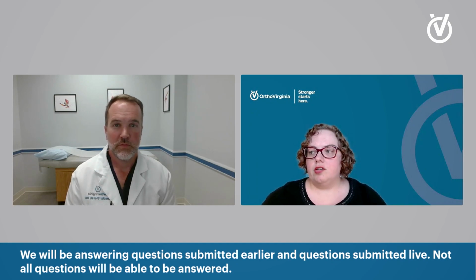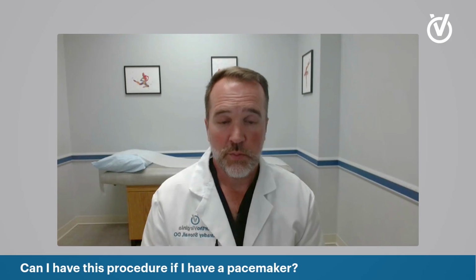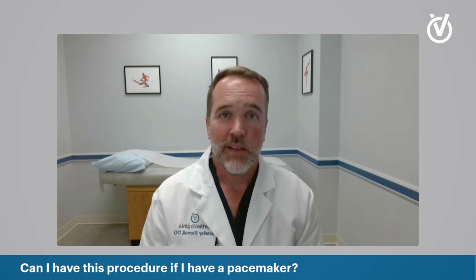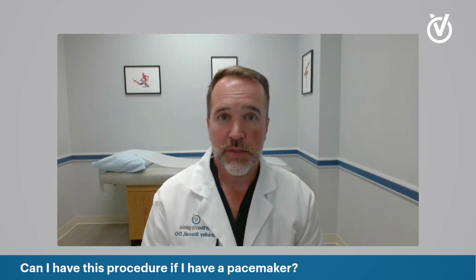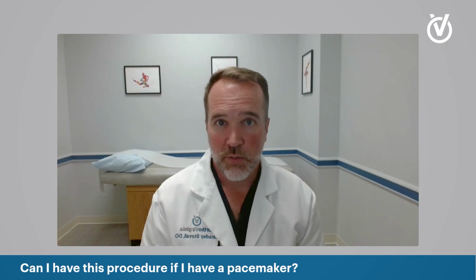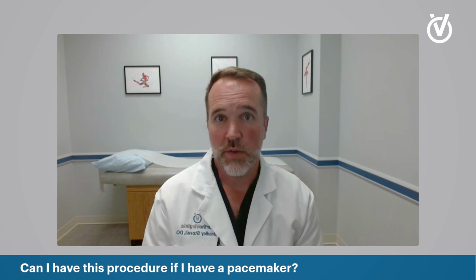Our first question is, can I have this procedure if I have a pacemaker? Yeah, so you can have the procedure if you have a pacemaker. When we do this procedure, when we get into the bone and we burn the nerve inside the bone, the technology we use just keeps all the electricity right at the level of the lesion site, so there's no interaction with the pacemaker. And being in the operating room, the pacemaker is monitored the whole time as well, but there's no interaction with the equipment with the pacemaker.